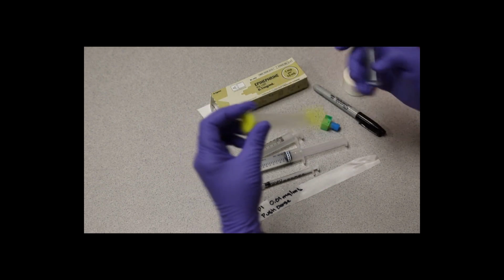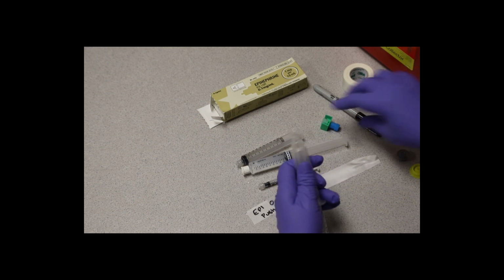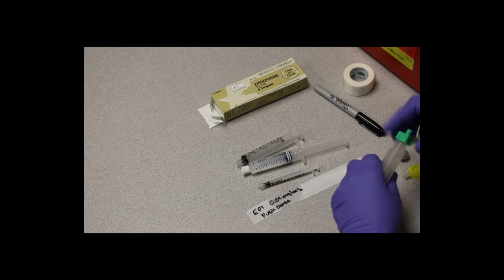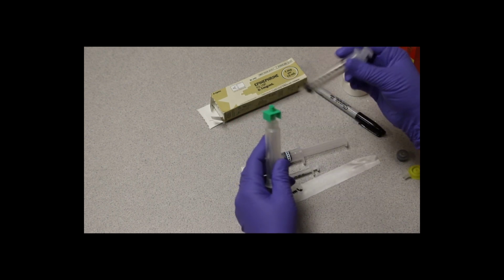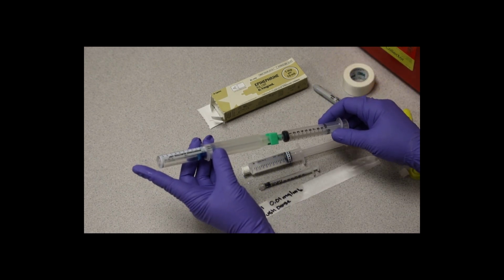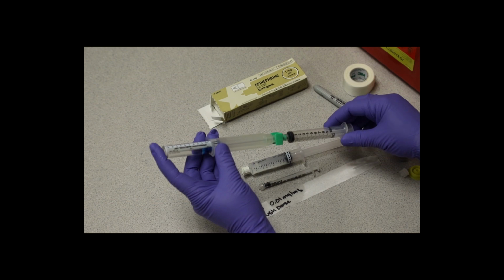Start by assembling the preload. Attach the syringe to syringe adapter and evacuate the air. Attach a 10 cc syringe, and you're going to draw up 0.1 milligram or 1 ml of the epi, 0.1 milligram per ml.